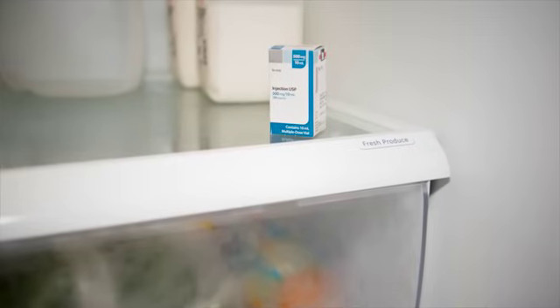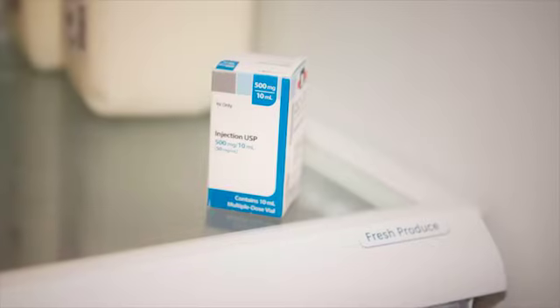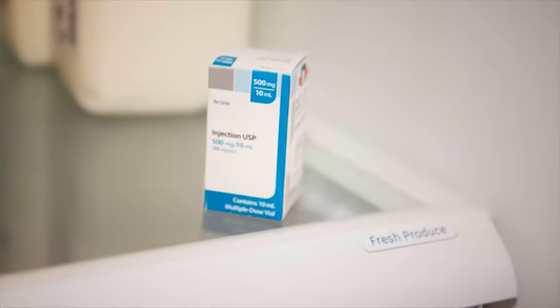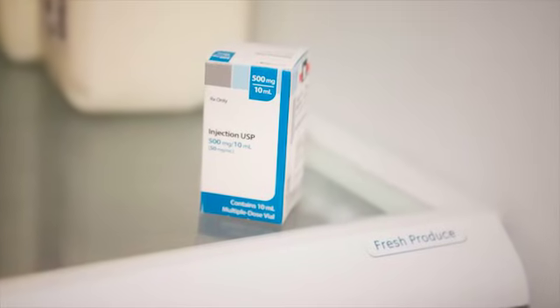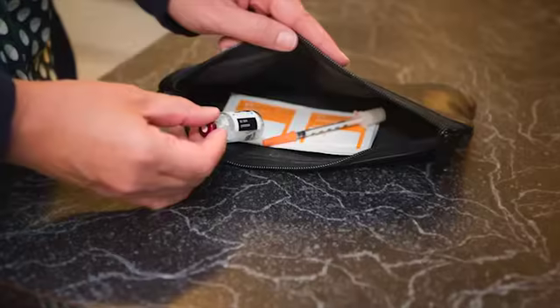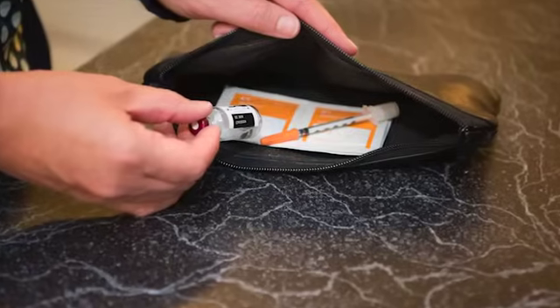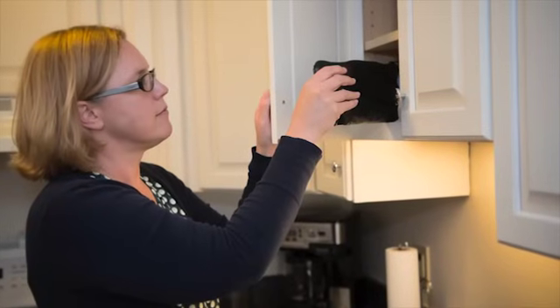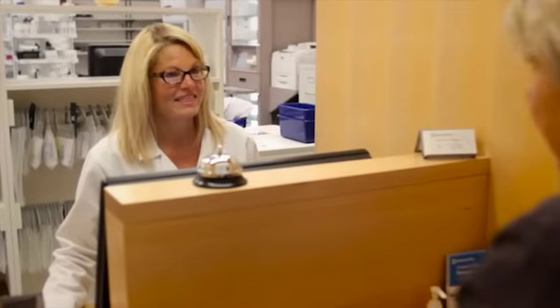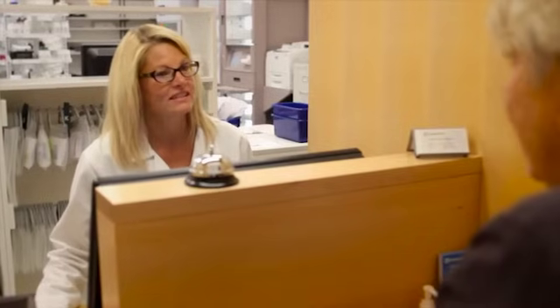When storing your insulin, store unopened bottles in the refrigerator. Unopened insulin stored in the refrigerator will be good until the expiration date printed on the box. Write the date on the bottle when you first open it, and store the bottle you are using at room temperature. Avoid temperatures that are too hot or too cold, as this can change how the insulin works. Most insulin is good for 28 days once opened.